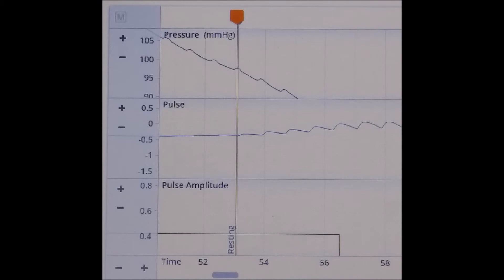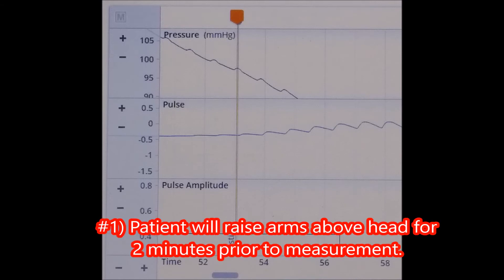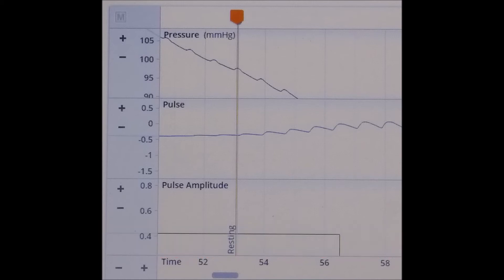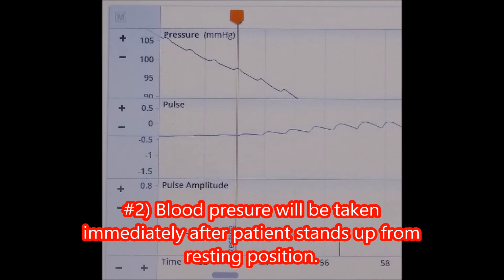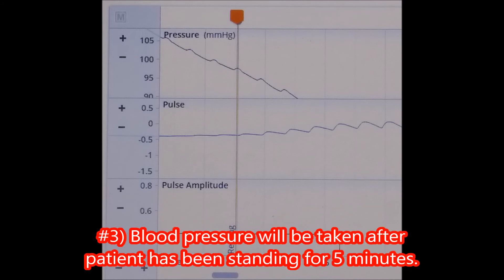We will use this same procedure to determine the patient's systolic blood pressure under three separate other conditions. Condition number one: The patient will raise their arms above their head for two minutes continuously prior to measurement. Condition number two: Blood pressure will be taken immediately after patient stands up from a resting position. And condition number three: Blood pressure will be taken after the patient has been standing for five minutes.